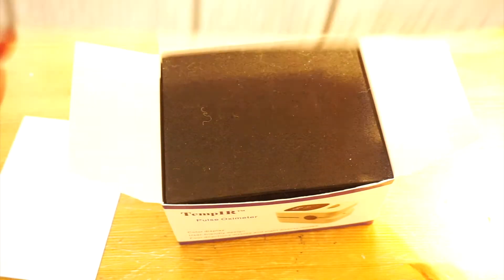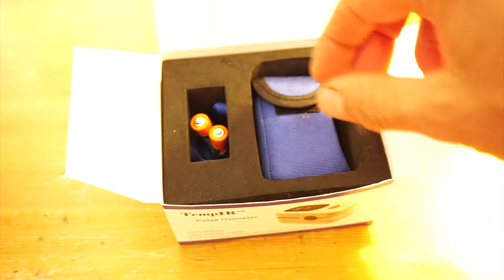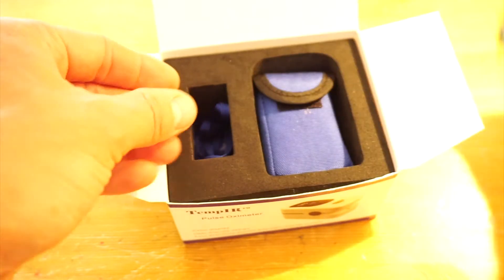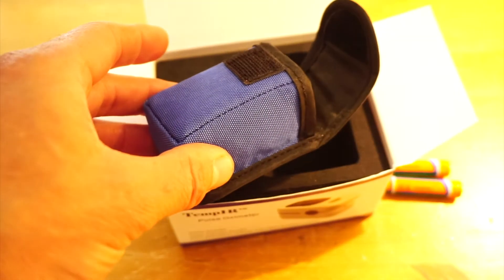The TempIR pulse oximeter comes with everything you need including some instructions, a warranty card, two AAA batteries, a lanyard to attach to the device, and a protective carry case.